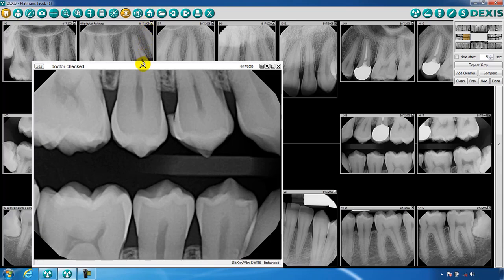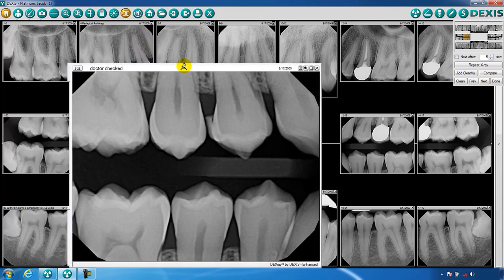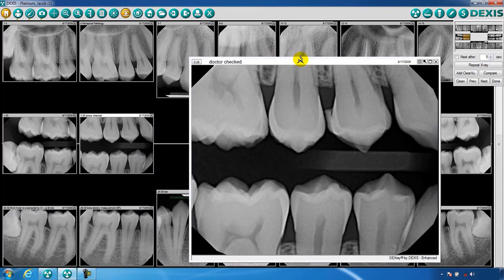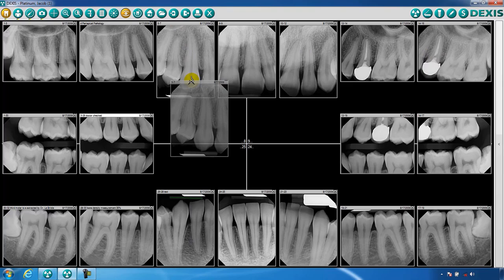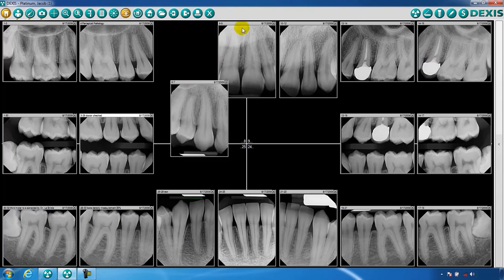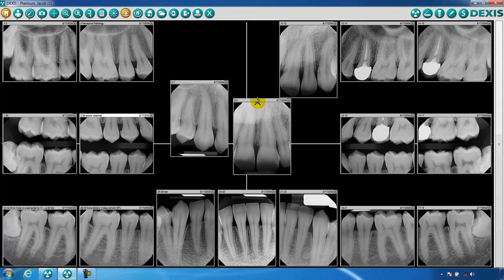With both small and enlarged images, a hook will appear at the top of an image. You may move the image around the screen by using the click and drag method. To reset your images back to the original location, click the house icon or click the B keyboard key.